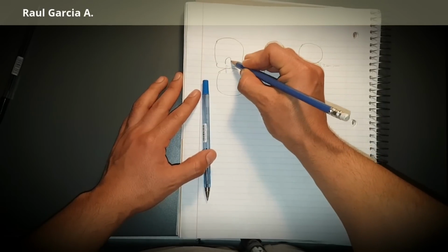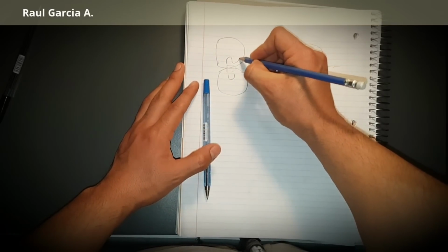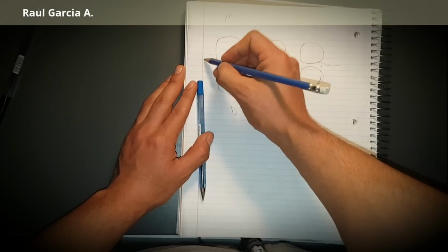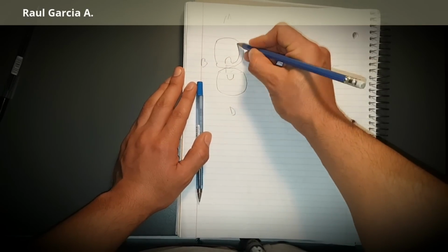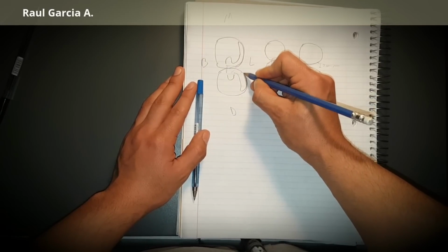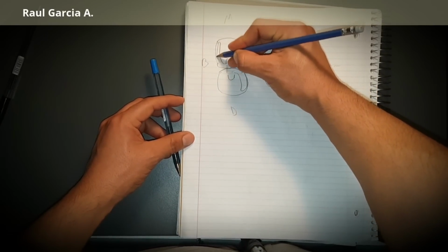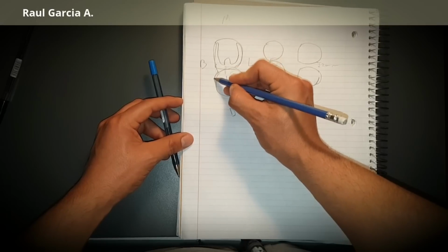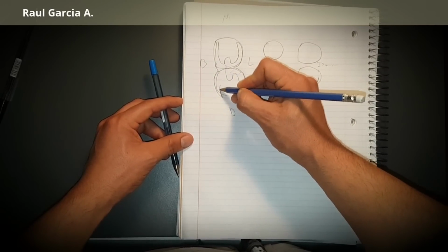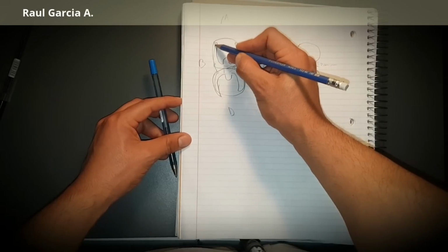So this is the design. So it is the occlusal rests, and then this, if we say this is the mesial, this is the distal, this is the lingual, and this is the buccal. These are the reciprocal arms. So it has two reciprocal arms, like that, and it has two retentive arms. So there's one here. You can draw them like that, first thick, and then it goes and ends pointy, like that.